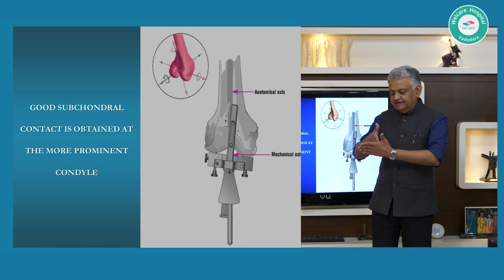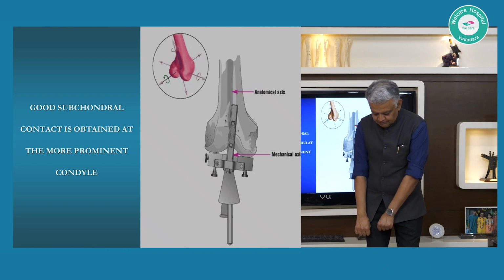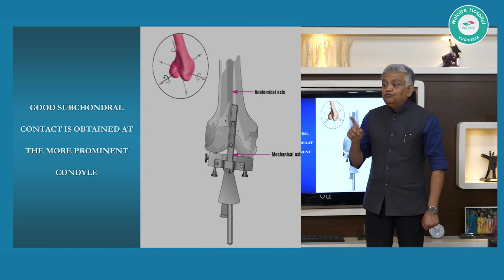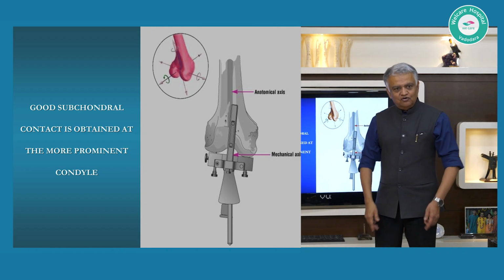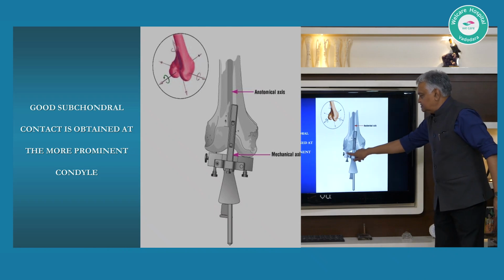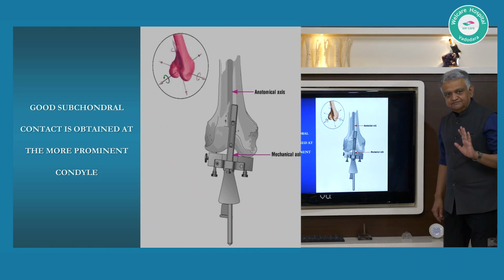आपने वो रॉड के ऊपर 90 डिग्री में ऐसा है वो ब्लॉक बिठा दिया और उस पर से कट कर दिया, तो that cut will be at 90 degrees to the anatomical axis. But no, you want it 90 to the mechanical. तो ये जो मैकेनिकल तो यहाँ से जा रही है, तो you want it like this. तो वो जो करना है, that way, if you want to do it as a precise calculation, get a scanogram and then draw the lines, and whatever angle comes here is the angle you have to put on that correction part here. तो ये जो है वो ऐसे गया, if it was even more then ऐसे गया, कम है तो ऐसे गया. समझ में आया?